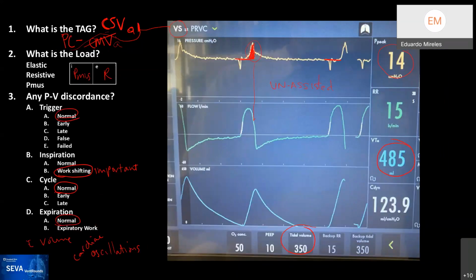You can now imagine that if you're doing a trial or a study, or trying to define how much support the patient is getting, if you don't know these nuances, you may think that the patient is getting some amount of support, right? Yeah, if you were to just look in the chart, someone probably would have recorded that pressure as the inspiratory pressure.